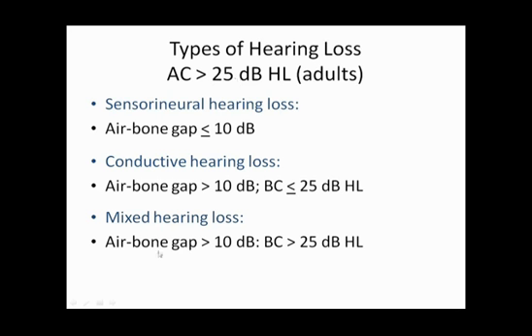A mixed hearing loss, air-bone gap is greater than 10 dB, and the bone conduction threshold is greater than 25 dB. That would represent a mixed loss.